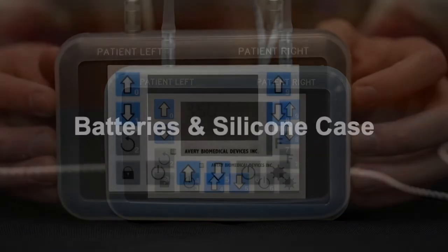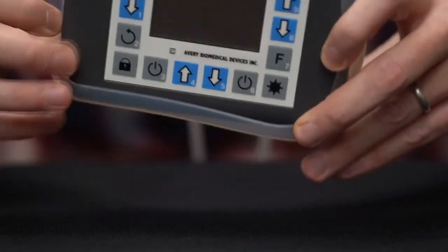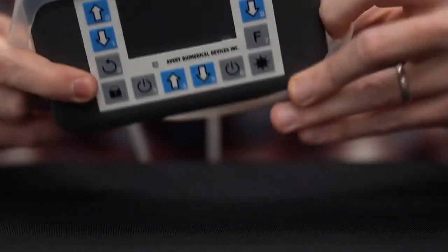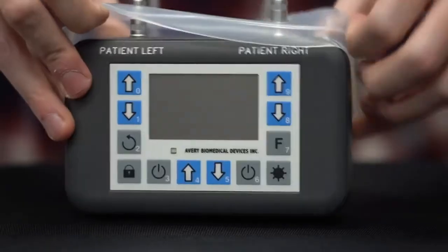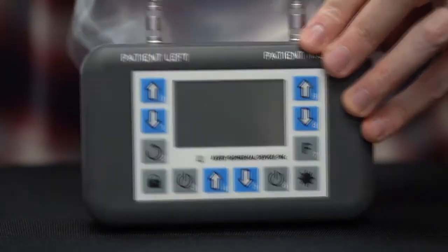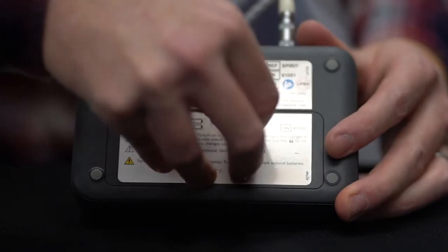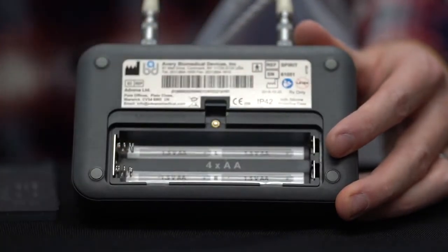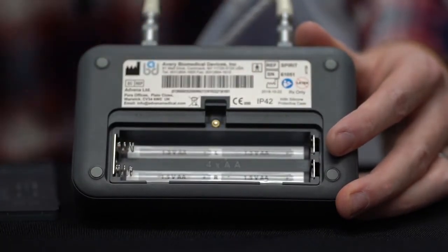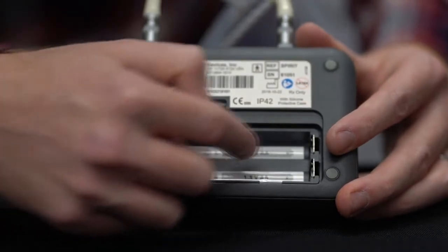Batteries and silicone case. Ensure that the Spirit transmitter is turned off. Remove the silicone soft case, which protects the transmitter against water splashes, shock, or vibration. Insert four new alkaline batteries, two for each side. Do not use rechargeable batteries. Locate and open the battery compartment and remove the battery compartment door. The L and R on the labels indicate each side, and the positive marker on the battery symbols indicates the proper direction.